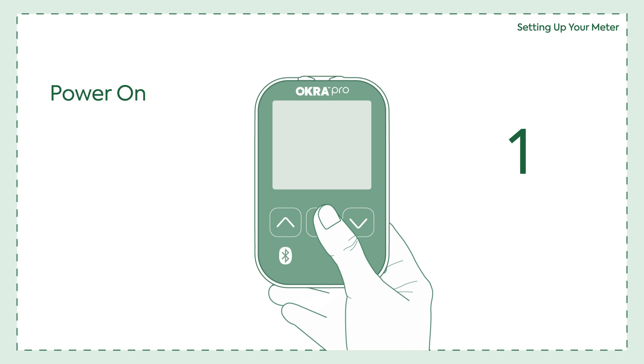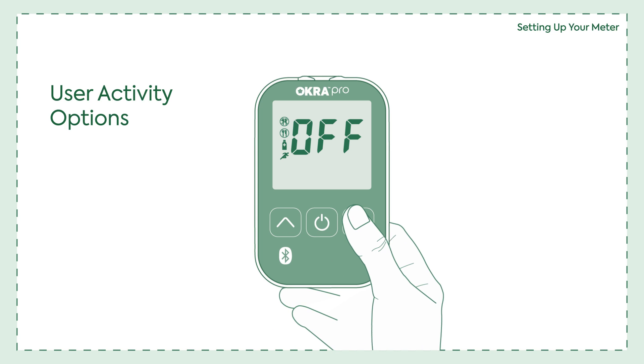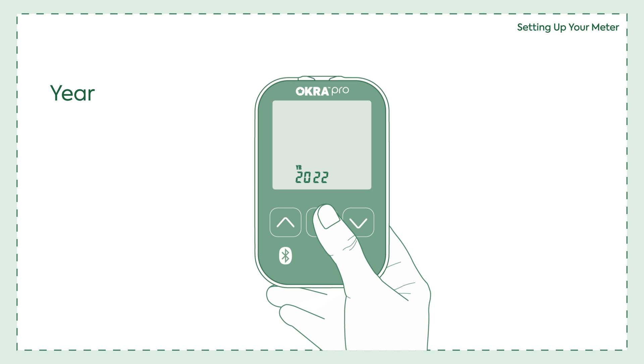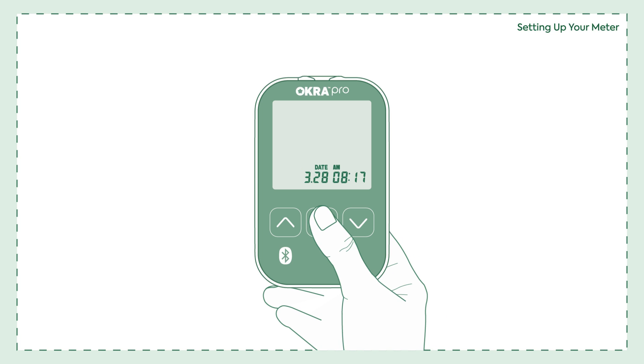To turn the power on, press the power button for at least three seconds. To turn the user activity option on or off, after pressing and releasing either the up or down buttons, confirm by pressing the power button. Use the up or down button to set the year and confirm by pressing the power button. Follow the same steps to set up each function.